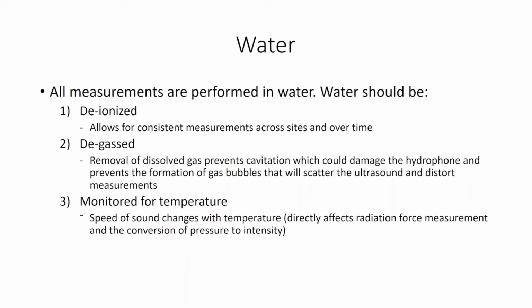So at this point, I always found it interesting that I learned that early in ultrasound, one of the manufacturers actually made all their acoustic power measurements in a tank that was warmed to 37 degrees centigrade, which frankly made things really quite difficult, because maintaining a body of water at an elevated temperature is a difficult thing to do and control tightly.